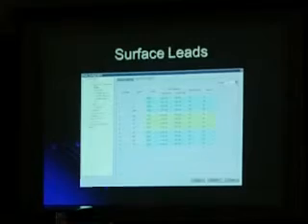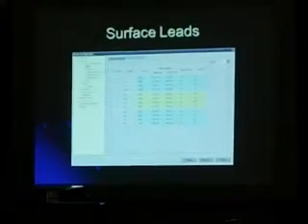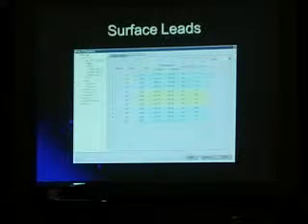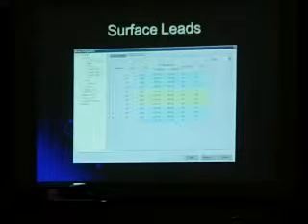Only in the EP lab can you turn a notch filter off for a surface ECG. It's defaulted on every single piece of ECG equipment out there. We're the only ones that allow you to do that. Because if they gave it to me, I'd have to switch it off.